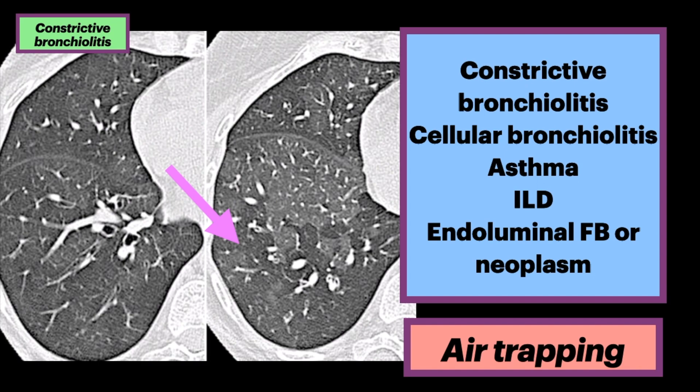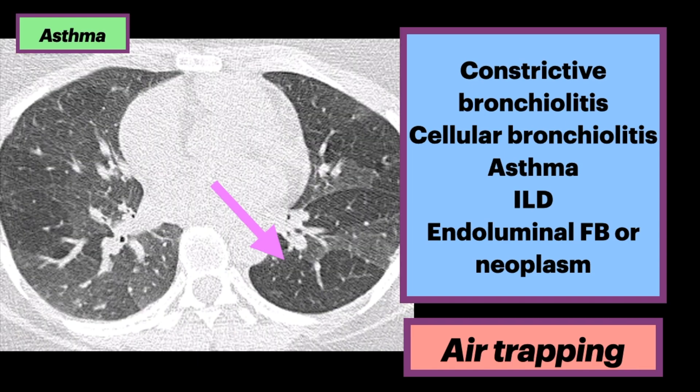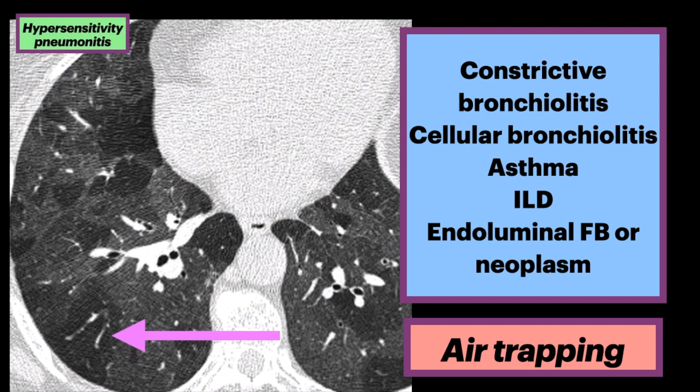On the left, we see a composite image showing inspiratory and expiratory views. This patient had constrictive bronchiolitis and shows subtle mosaic attenuation on inspiration and frank air trapping on expiration. Here's a patient with asthma — note the areas of air trapping. In this patient with hypersensitivity pneumonitis, there are multiple foci of hyperlucent lung due to expiratory air trapping.